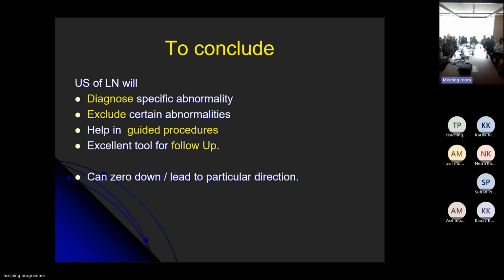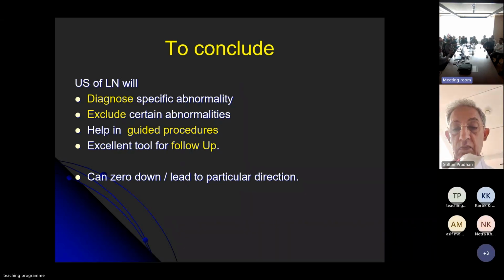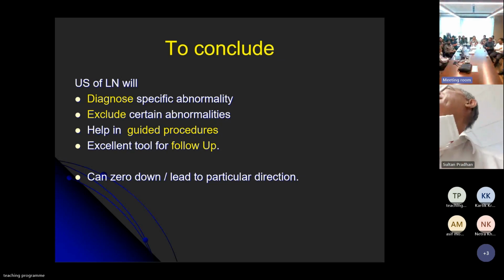We talked a little bit more towards the head and neck, but in breast there will be a slight difference, because one of the important things is that the nodes do not have necrosis or typical change the way we see in the neck. So in breast, what we really look at is the cortical bulge. If there's focal cortical thickness in one particular corner of more than 3 millimeters, we will call them abnormal. So that is the difference.